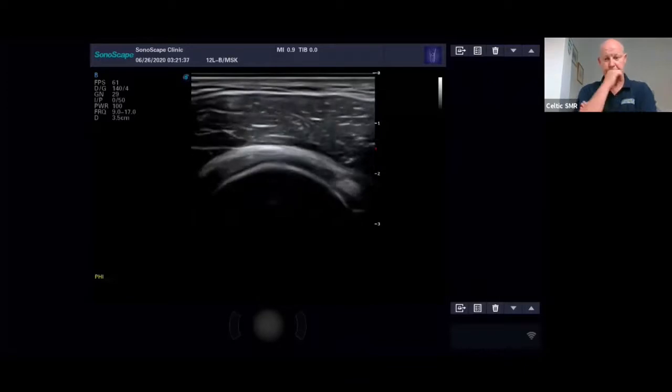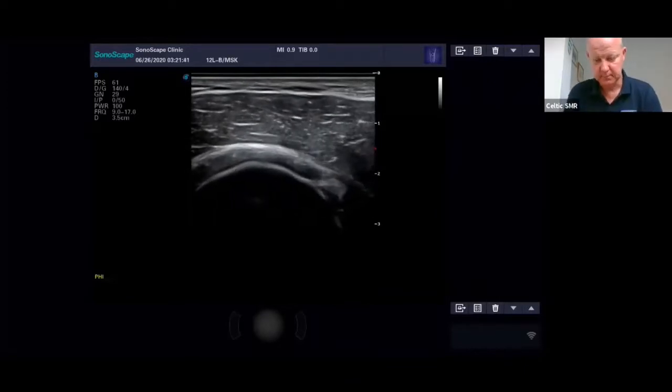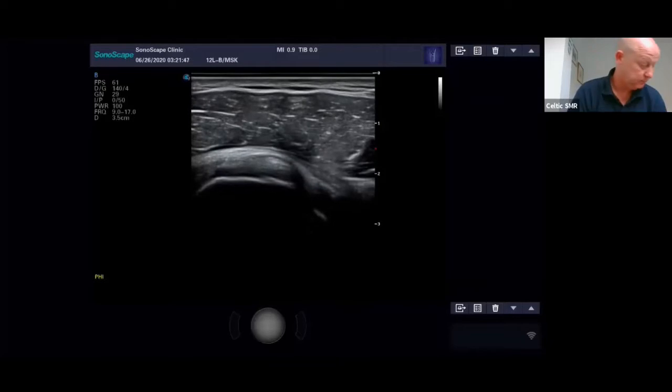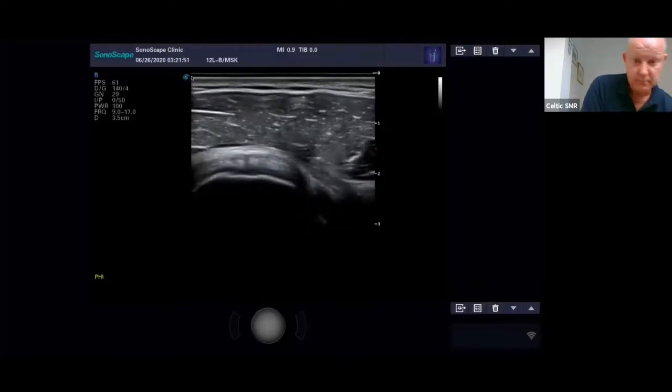Okay, so now the biceps is on the right side, and if you look at the screen, it's on the right side here. So I know that's correct. The way you can tell that is this little S at the top here. That's where your probe marker is, and that's your orientation.